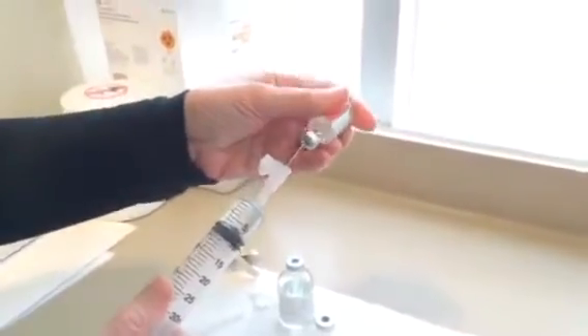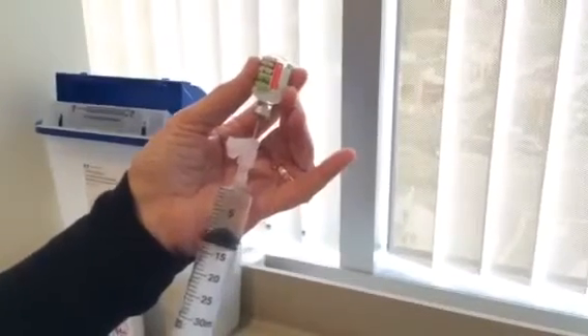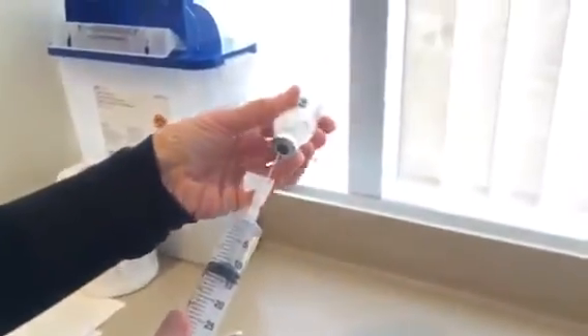Next, 40,000 units of heparin. This is thought to help recreate the GAG layer — the glycosaminoglycan layer — inside the bladder, which is formed of heparin and a few other molecules. It's thought that missing heparin is part of the pathophysiology involved in the development of interstitial cystitis.